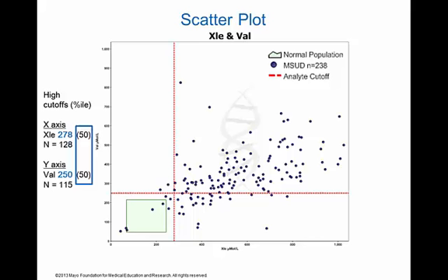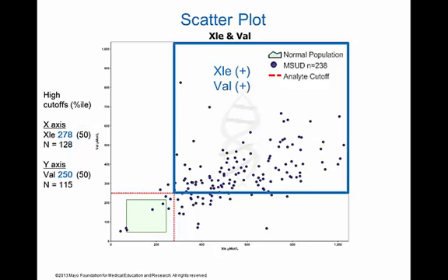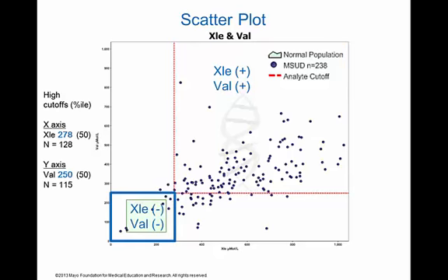The red lines divide the plot in 4 quadrants. The top right quadrant shows all cases with results exceeding both cutoff values. At the opposite end of the spectrum, the bottom left quadrant shows how many cases would have been missed using the same parameters. Indeed, some of them are documented false negative events added to the R4S database after clinical ascertainment.